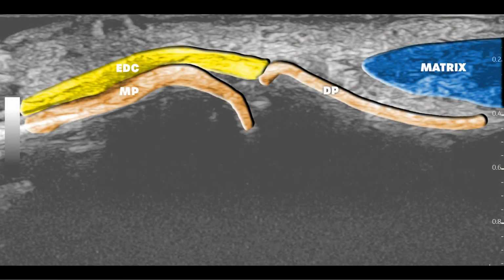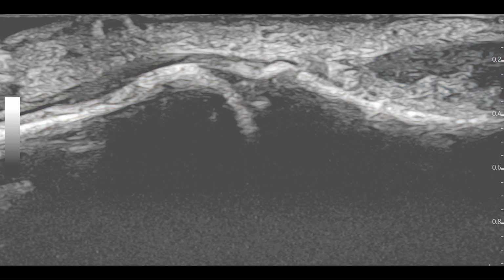We position the ultrasound probe longitudinally over the dorsal aspect of the DIP joint, allowing a clear view of the extensor digitorum communis tendon enthesis next to the joint. Dynamic flexion and extension of the DIP joint helps us check tendon integrity, better visualize sliding layers between structures, and detect subtle synovial inflammation.